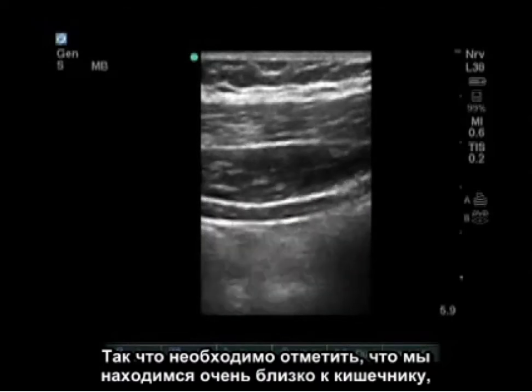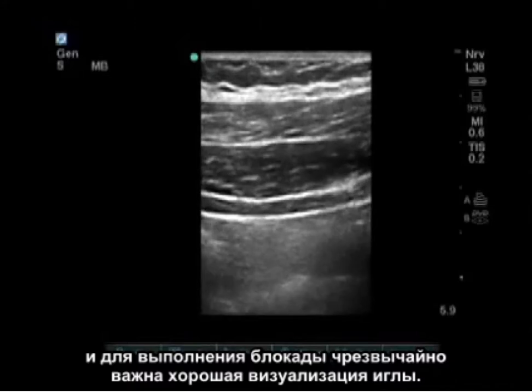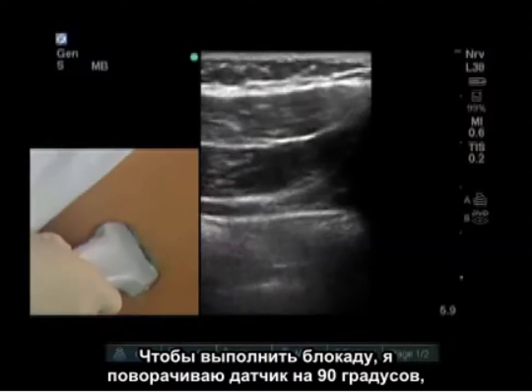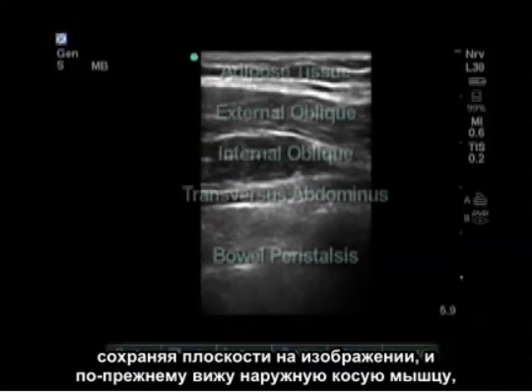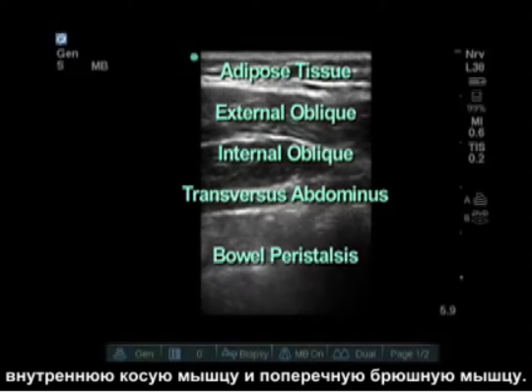It's very important to note that we are getting very close to bowel, and good needle visualization is important for doing this block. To actually do the block, I turn my probe 90 degrees, keeping those planes on the picture. I still see the external oblique, internal oblique, and transversus abdominus deep.